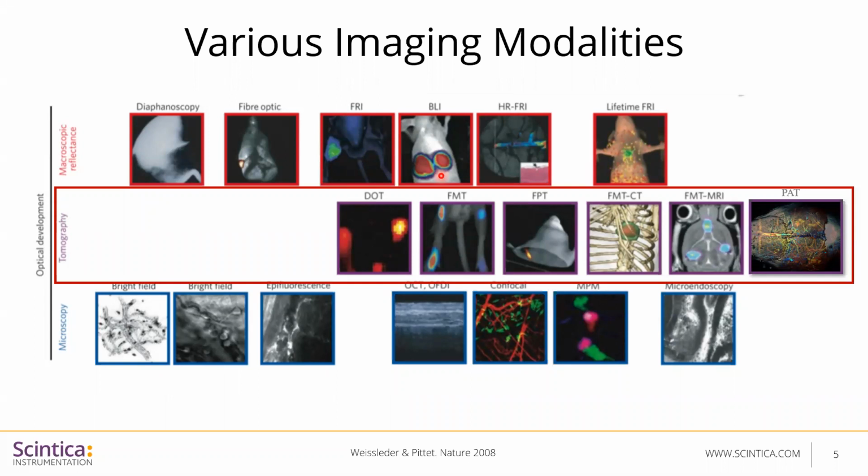For today's talk, we will be focusing on tomography, specifically fluorescence tomography and photoacoustic tomography. And both these sources, as I have already mentioned, utilize light as the main source or input.